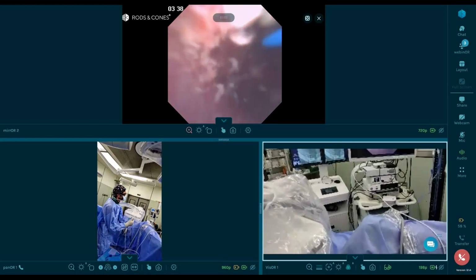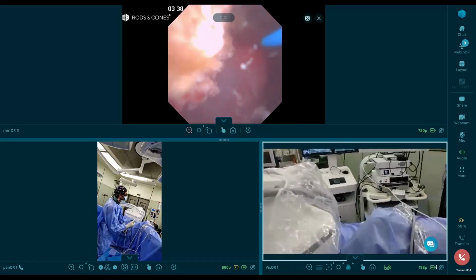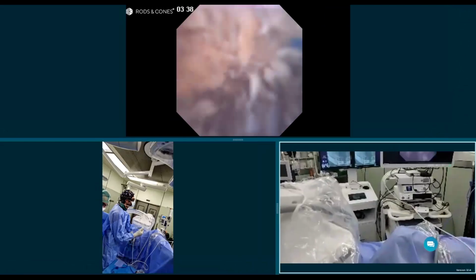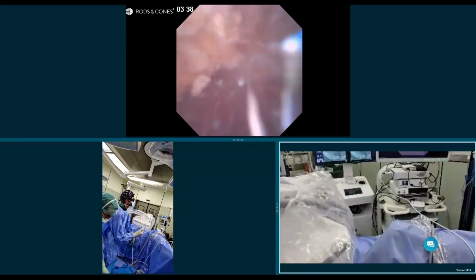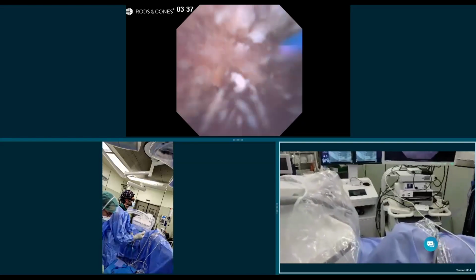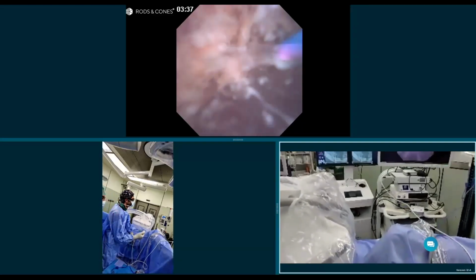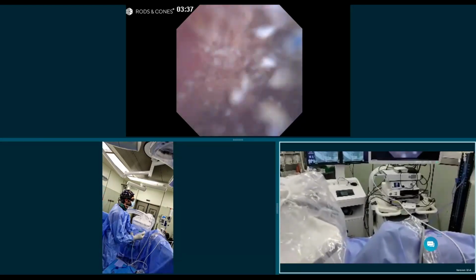I think we've done a pretty good job. Remember that the fiber is 200 microns, and we now have stones, or fragments, that may be less than the fiber, so less than 0.2 millimeters. So this is going to be very well expelled.